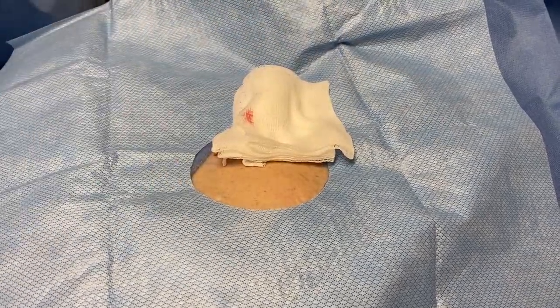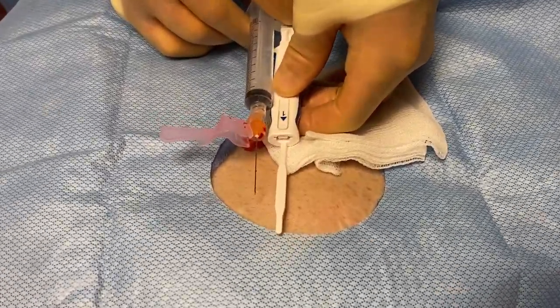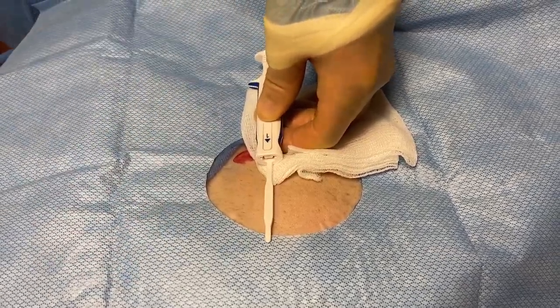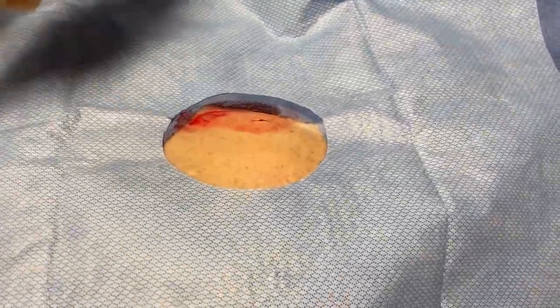The nice thing about this model is that you compare the insertion tool to the length of your needle, and we want to be sure to push the needle just a little bit into the skin so we account for the entire length of the insertion tool. And this is very nifty.